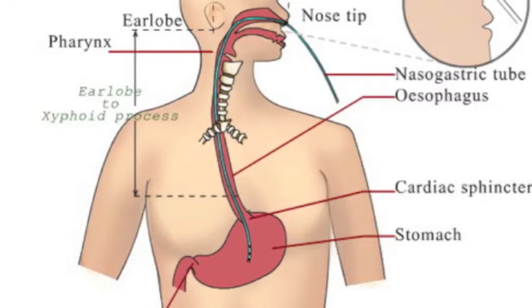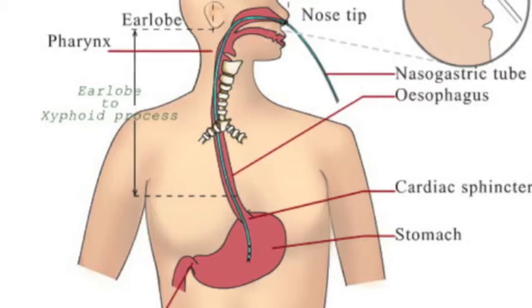Now, troubleshooting an NG tube. You always look at the patient first, then follow your connection, okay? If the patient says they are nauseated and you come in, you look at them, you follow your connection, and your canister is full, why are they nauseated? Yes, every time.